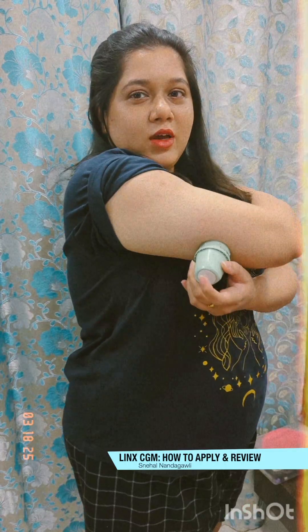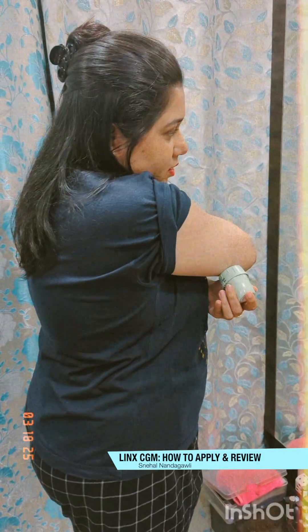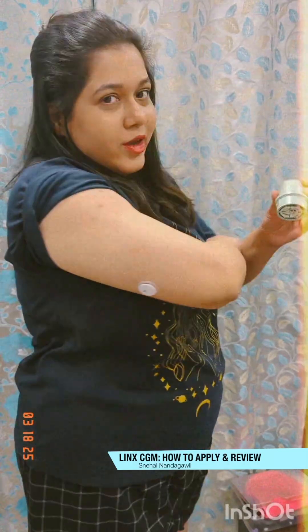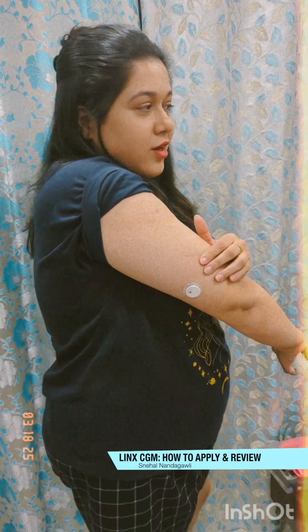Okay, here we go. I waited for a couple of seconds — let's see if it's done or not. This was pretty easy. I think I just had to punch it in a little harder, which I missed the first time, but this is how the sensor looks like and it's quite tiny.